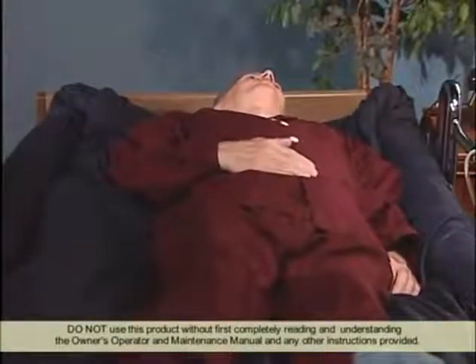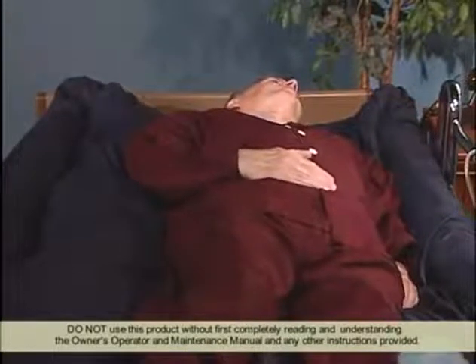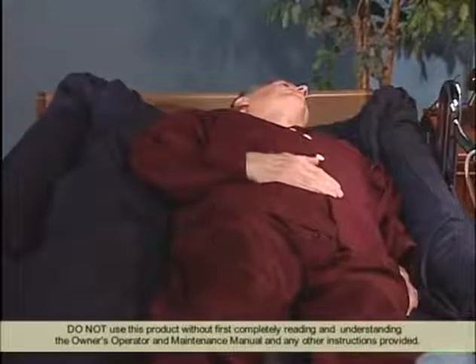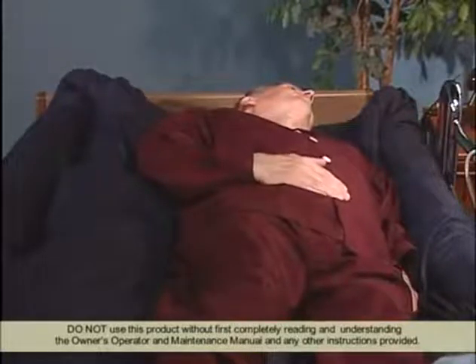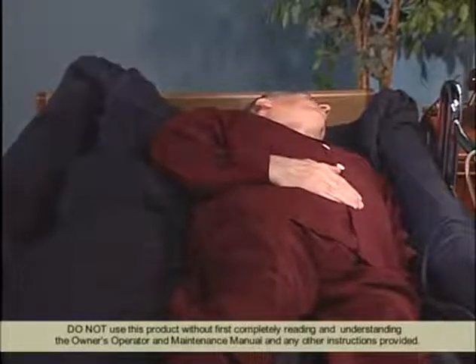The advantage of a lateral rotation mattress is that the mattress will turn the patient. Without this type of unit, a caregiver would have to come in, manually turn the patient, prop them up with pillows or wedges, and achieve the proper tilt that way. This mattress does the turning of the patient for you.